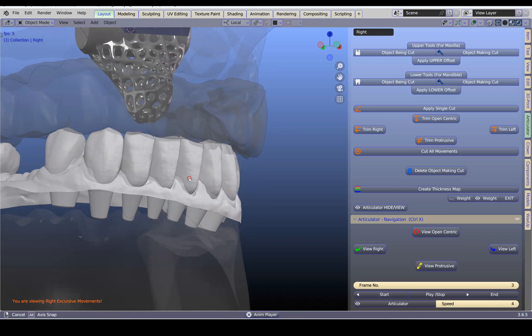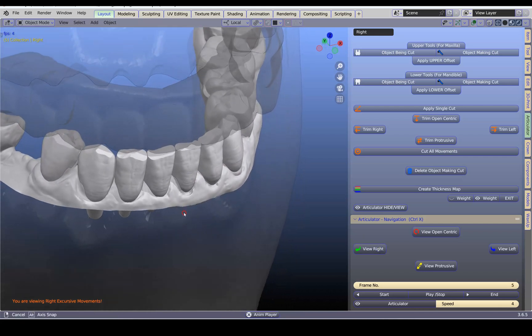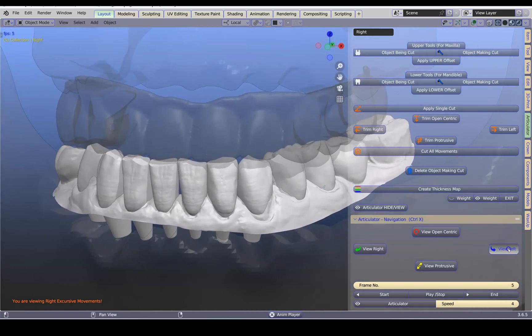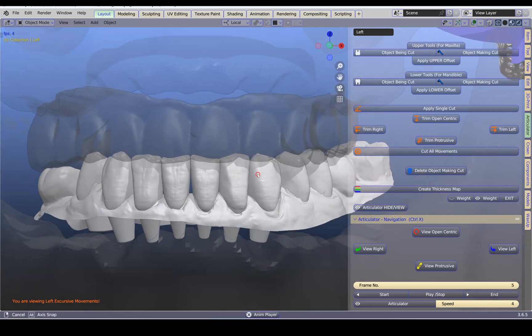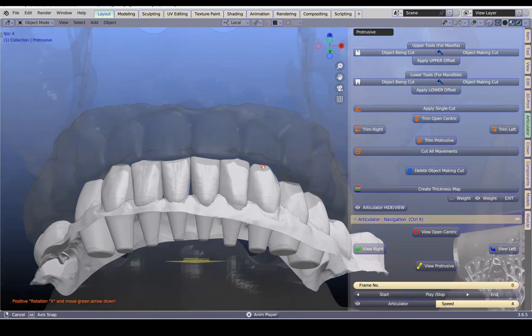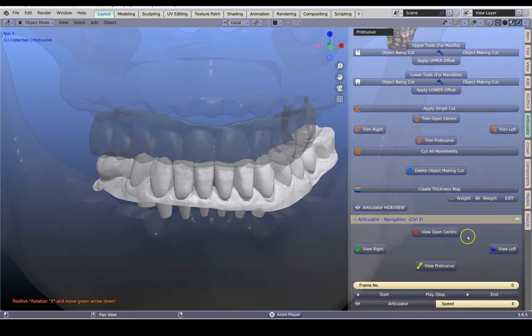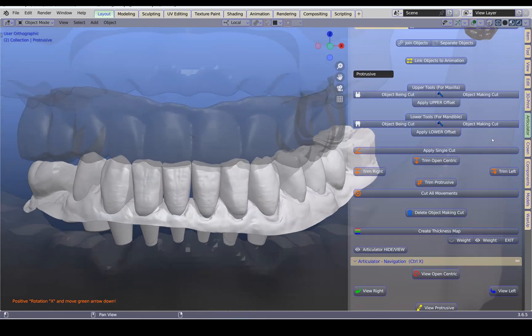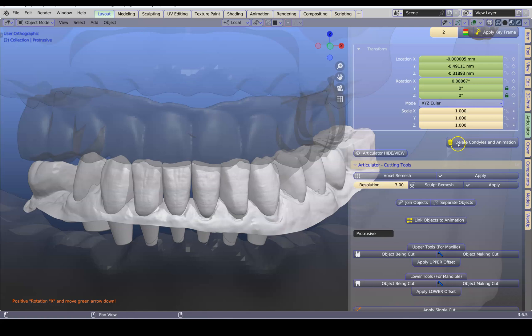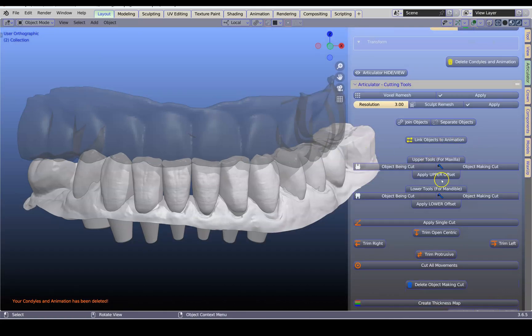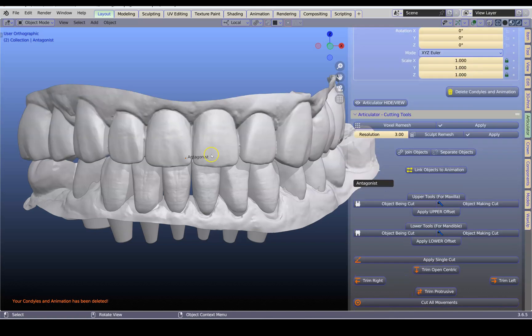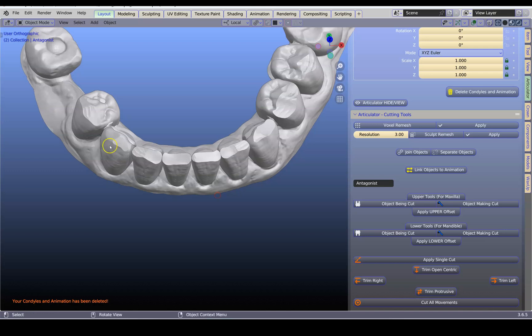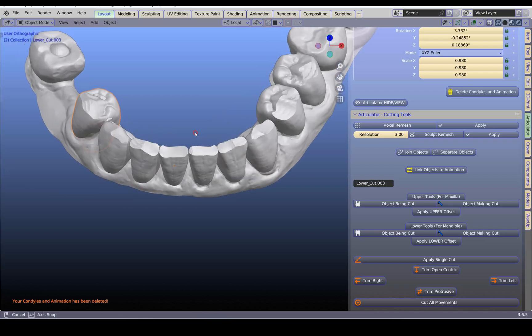Finally you can stop the animation or view the animation if you want to. It's always amazing how it has been trimmed according to the condylar movements in all directions. Finally, navigate to the button to delete the condyles and animation, and delete your cutter. This is totally complete and this would be the starting point for making your crowns.